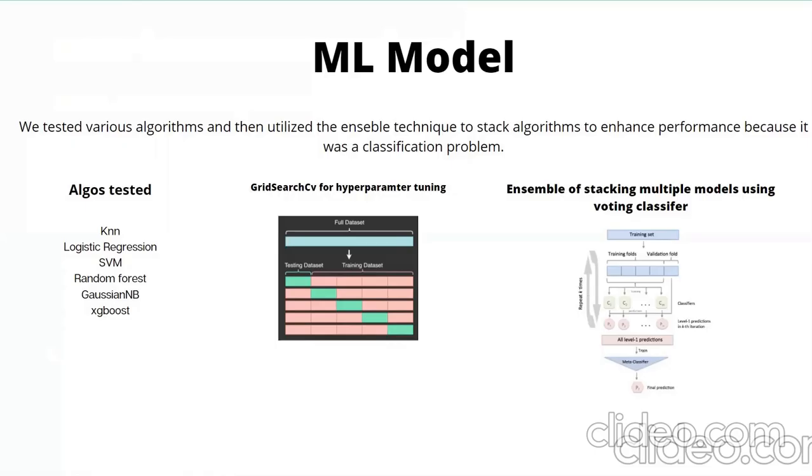The output of each model was then passed to a voting classifier. The method that we used for the voting classifier is basically soft voting. That is, it gets the probability from each model, and the label which has the highest probability will be taken as the final prediction.